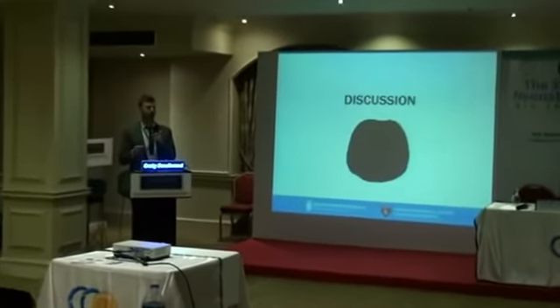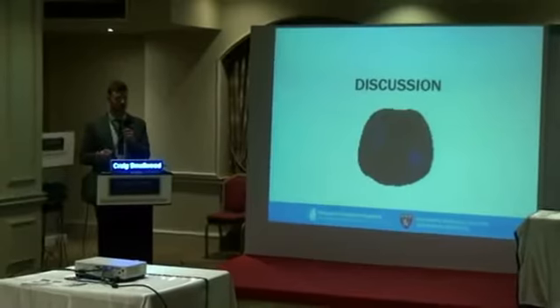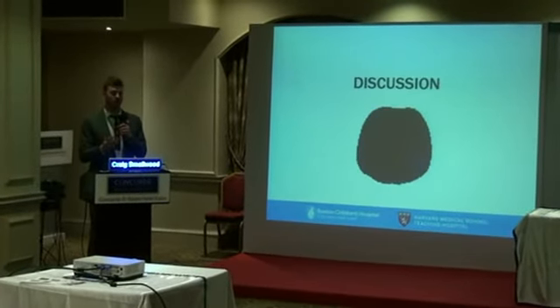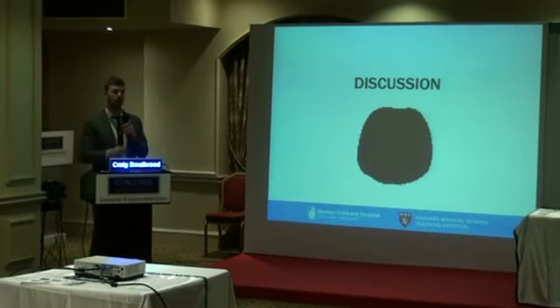The way we've gotten around that in the meantime is that we have, I think right now, 4 separate IRB-approved protocols that allow us to use EIT. We actually do have doctors who page me or call me and say, Craig, I want to use EIT because I'm not sure if this patient is going to respond to proning, or I want to do a PEEP optimization procedure and I want to know the regional distribution. I have to say no, unless we enroll them in a trial.